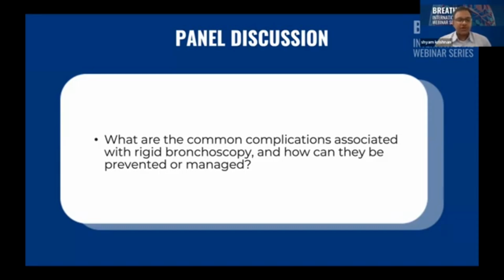The complication rates vary from study to study, but the thing is, it is context based. Mostly rigid bronchoscopies are used in patients who are very critically ill. It depends on how stable the patient is, if it's an elective rigid bronchoscopic procedure you're doing, or an emergency one. So complications, it's very tough to generalize them. You should view it in the context.